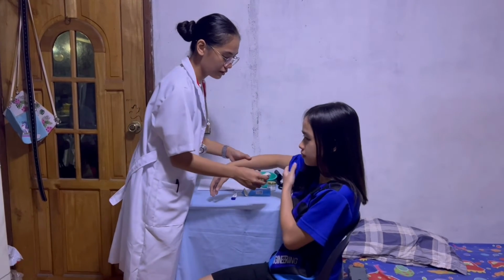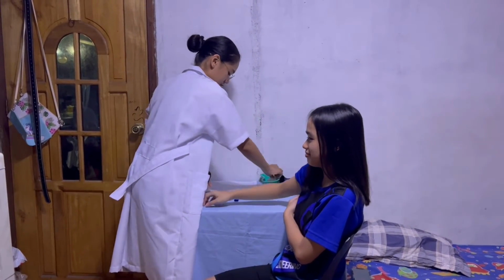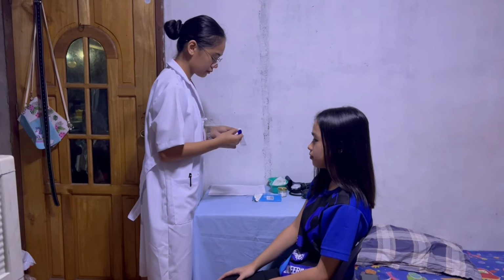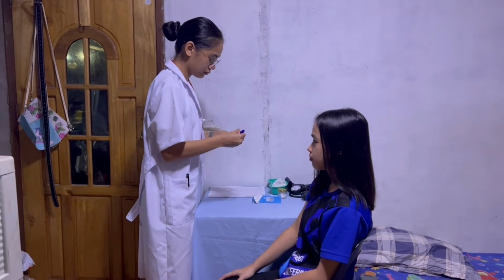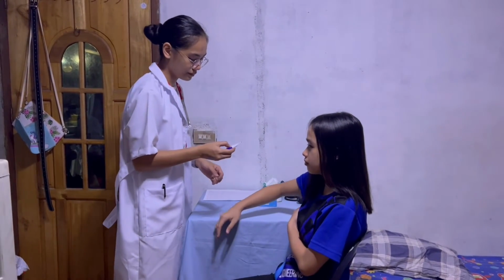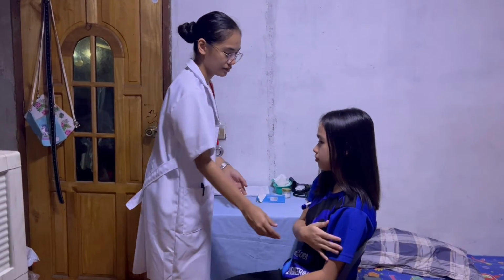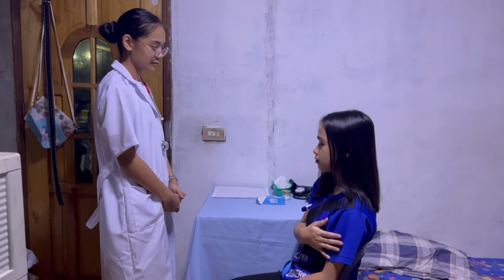For the axillary temperature, pat the axilla if very moist. Apply a protective sheath to provide a barrier to prevent transmission of organisms. Place the tip of the thermometer in the center of the axilla, then position the client's upper arm down with the lower arm across the chest.